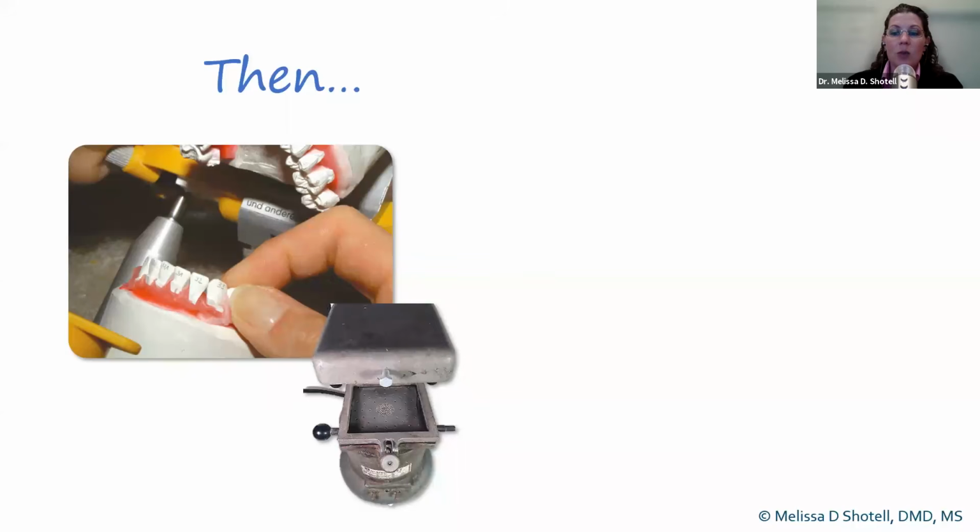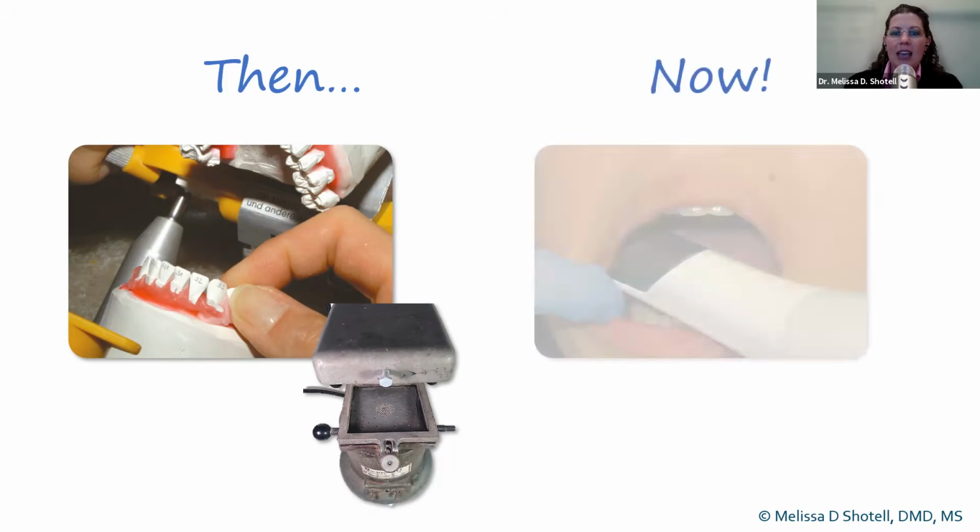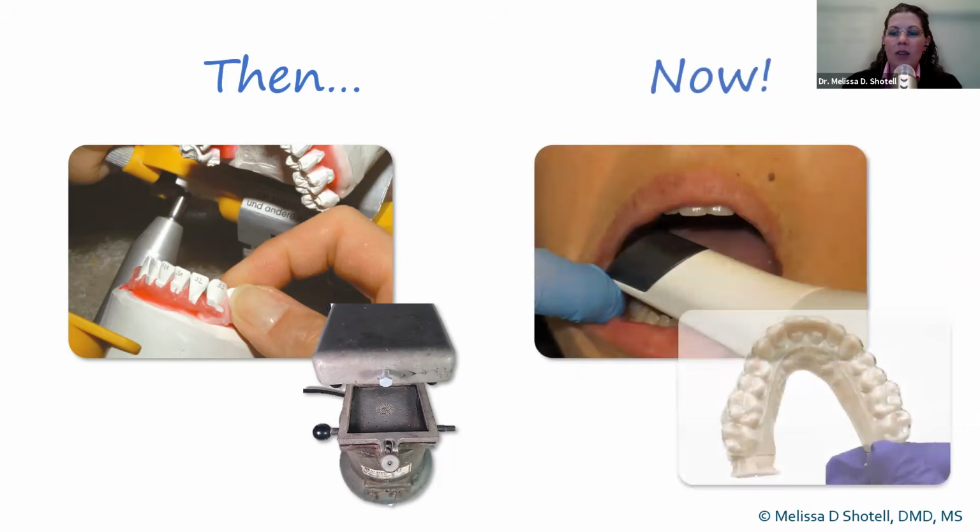For years, doctors wanting to perform clear aligners had to section the models and reset the teeth. I can say that I have had to go through this exercise in residency, and it's something that I wouldn't want to return to. However, I find it amazing that a process that started in office, then went predominantly to mass scale laboratories, has come back to us now in an in-office process that we can control. It's much more high tech now, starting with an intraoral scan, but we can take our in-office intraoral scan and go through the entire laboratory process in our own office to create clear aligners for our patients.